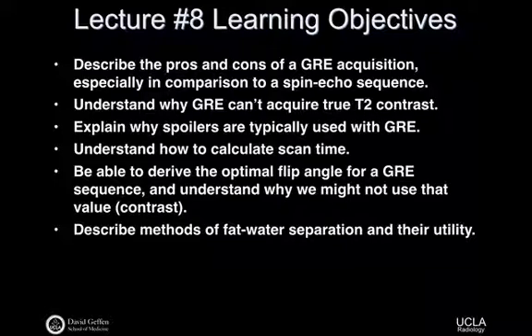And then I think at the very end of that lecture, he was able to get into some principles of fat water separation and what that might be useful for. Who can suggest something about what was the basis for being able to do fat water separation? What's different about fat? Yeah, so they do have different phase, but what is it that gives them different phase? Chemical shift, right? So fat has a different resonance frequency.